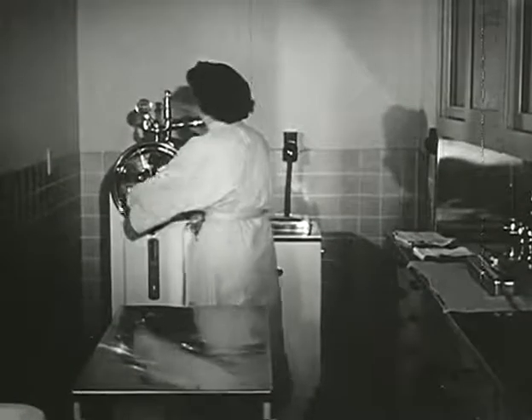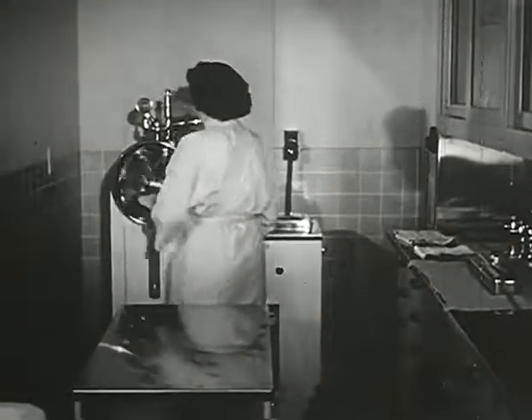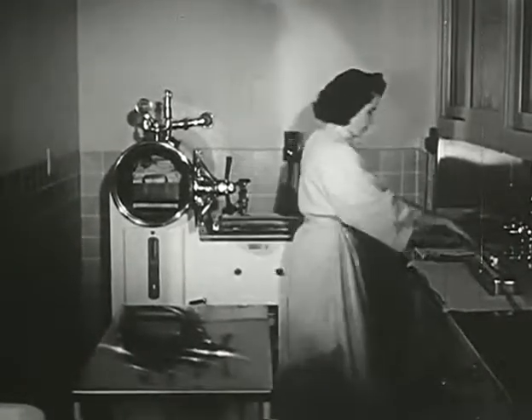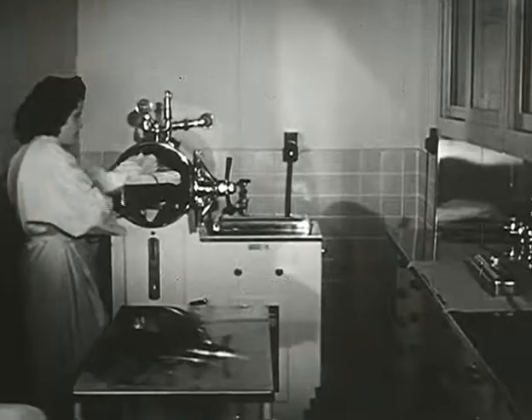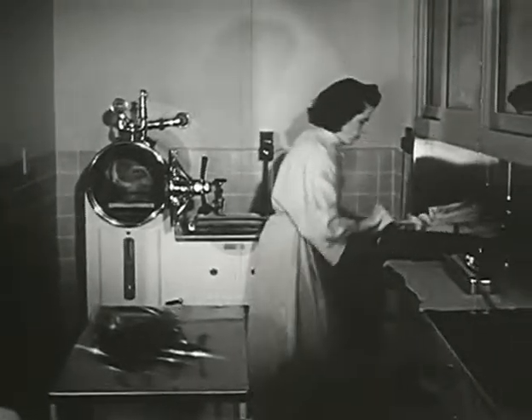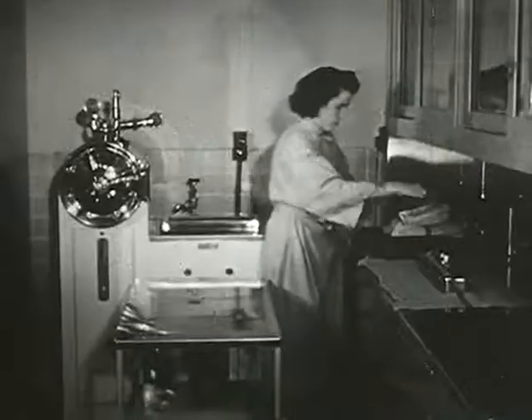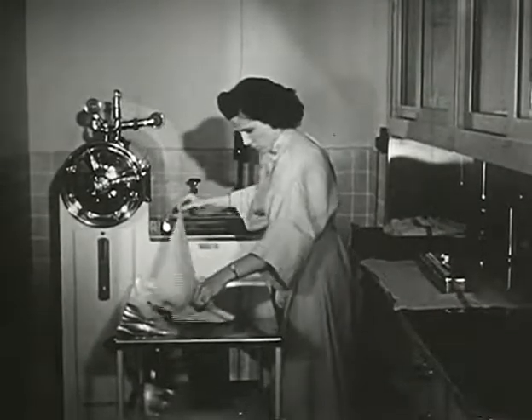Sterilization of surgical materials may be accomplished by heat or by chemicals. Dry goods and all instruments except cutting-edge instruments may be sterilized in the autoclave. A complete set of sterile instruments is always kept in readiness for surgical needs. First, a sterile field cloth goes on the working table.